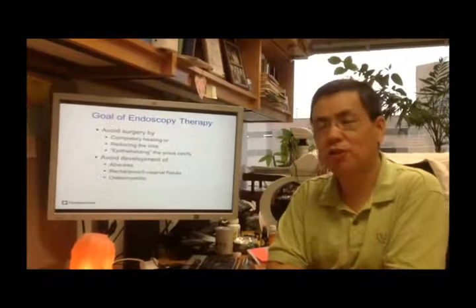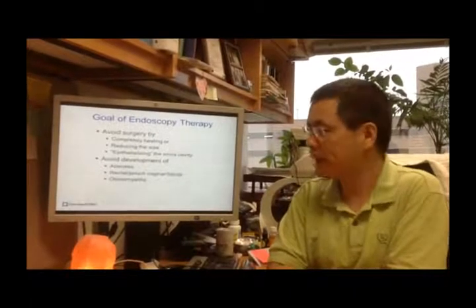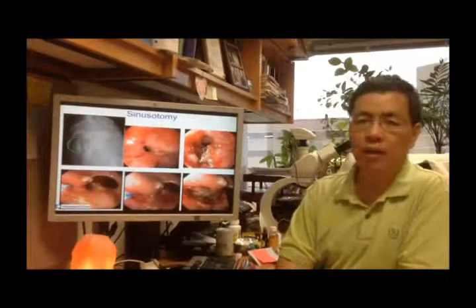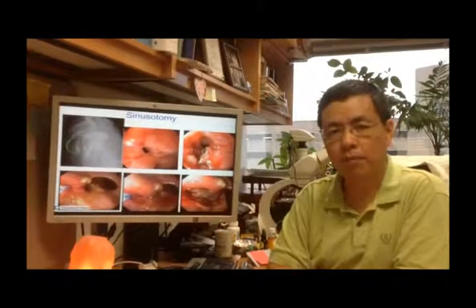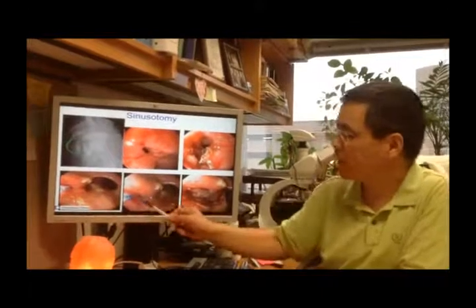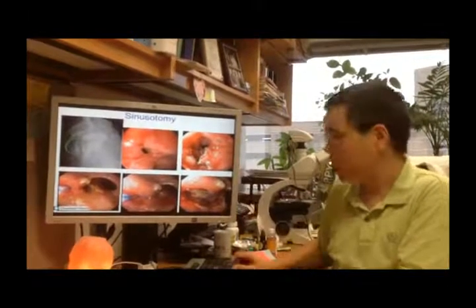The goal is also to epithelialize the sinus cavity, making it a diverticulum, and to avoid development of abscess, vaginal fistula, or osteomyelitis. Here is an illustrated case: the sinus is behind the pouch body. This patient actually has two sinus openings. Using a needle knife, we open it — this is the sinus cavity or chronic abscess cavity — and the patient was cured by therapy.